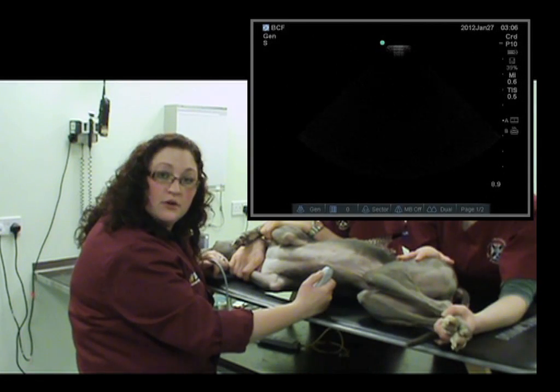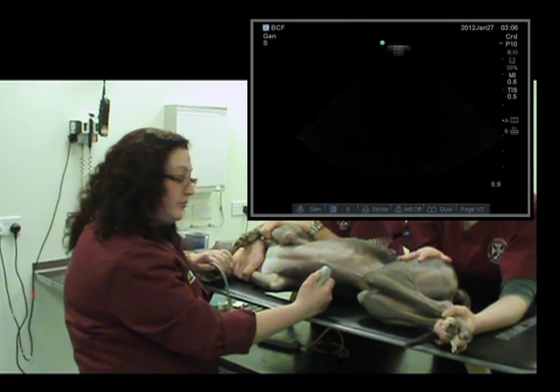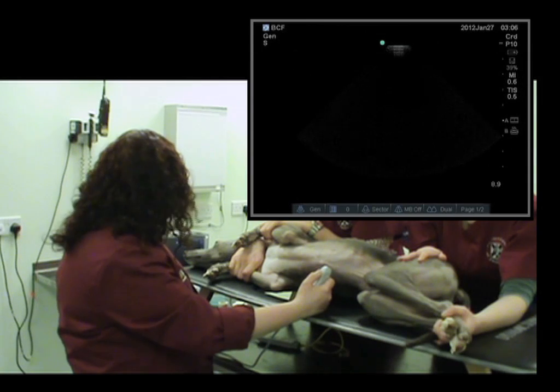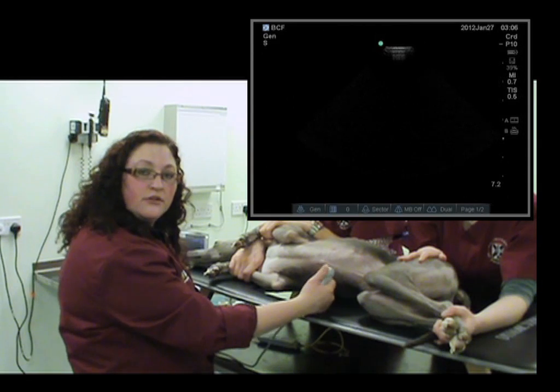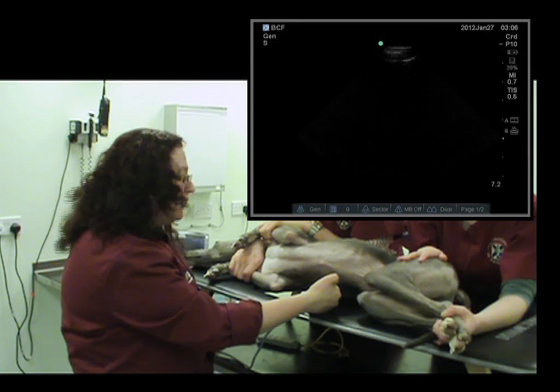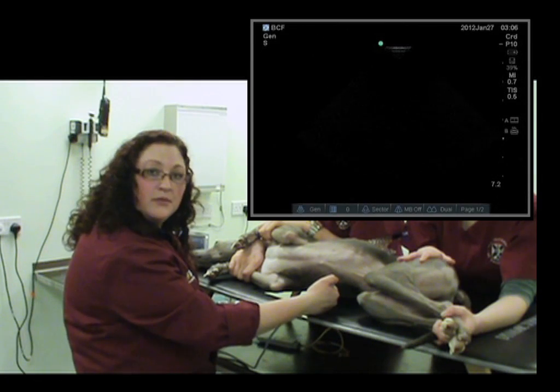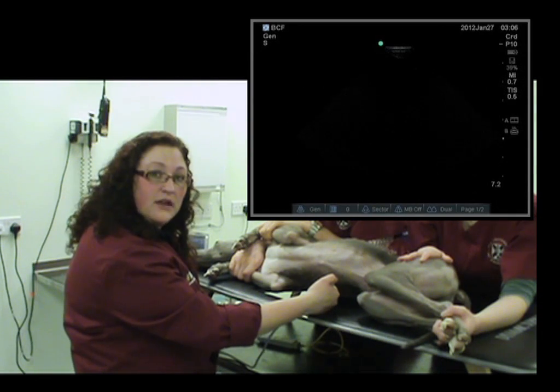The next thing we need to do is recognize the buttons we need to be changing throughout the exam. The main ones will be the depth — I'll just demonstrate this on the machine. We can change the depth, we can also change the gain, which is overall how bright or dark an image is, and we'll demonstrate this with a live image in a moment. We can also change things like the frequency and the time gain compensation.